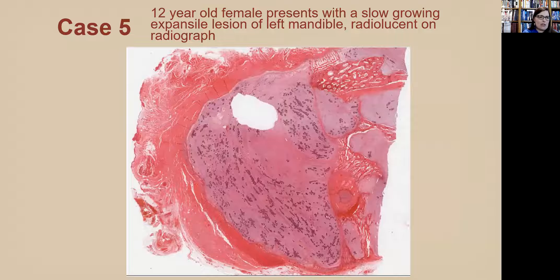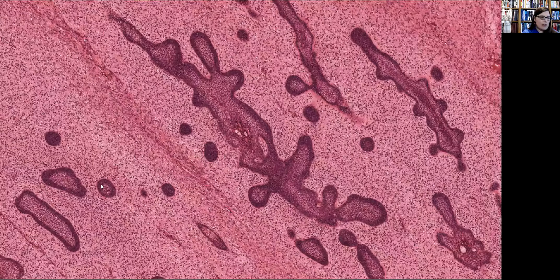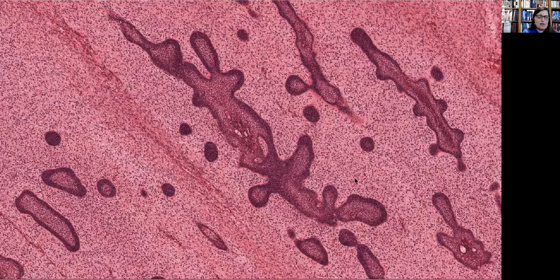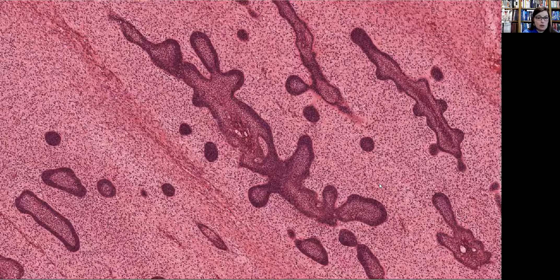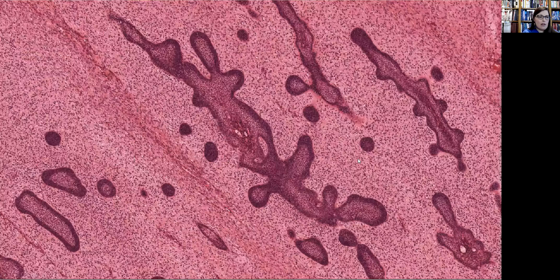Case five is a 12-year-old with a slow-growing expansile lesion of the left mandible that is radiolucent on imaging. The stroma is a bit revved up and more cellular, with a few scattered mitotic figures, but not sufficient to call it ameloblastic fibrosarcoma. We do have islands of ameloblastic epithelium within a primitive mesenchymal stroma. This case was an ameloblastic fibroma.